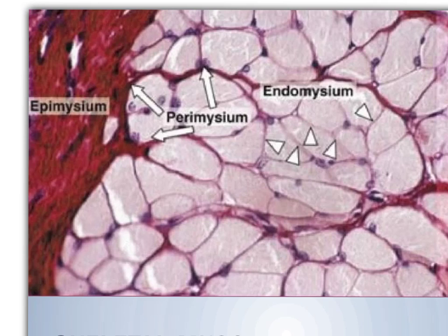And finally you will find this very delicate connective tissue in between the muscle fibers. This is the endomysium, and it is formed of reticular fibers containing very fine blood vessels and nerves. So the very thick layer on the surface is the epimysium, formed of dense connective tissue. Then the connective tissue surrounding the bundle is called the perimysium, formed of less dense connective tissue. And inside the bundle itself, around the individual muscle fibers, we have a reticular connective tissue, which is the endomysium.